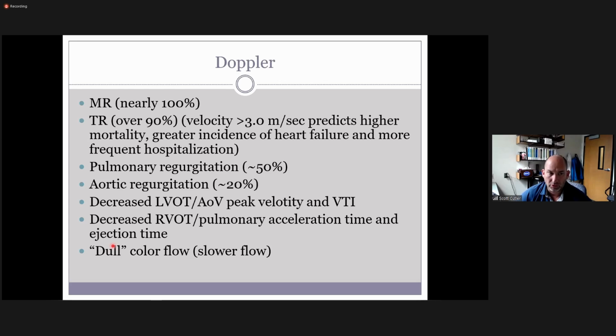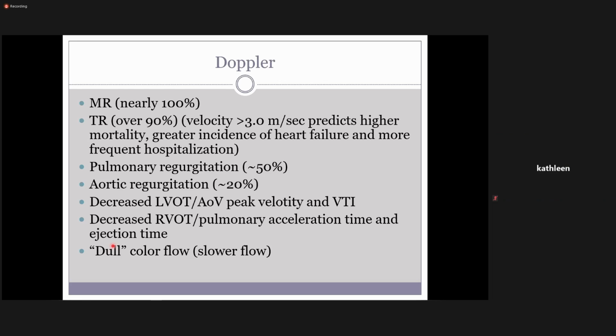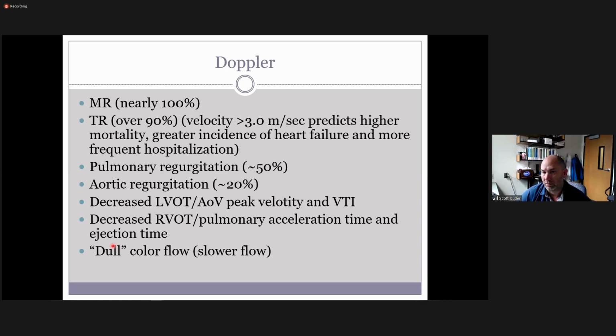They'll take their pictures and then they'll do the measurements after. As a student, I don't like you to do that because I want you to know why you're getting it and to do the measurements accurately. And what you often find when you become a tech that's experienced and very, very comfortable with what you do, you know that you have good enough images.